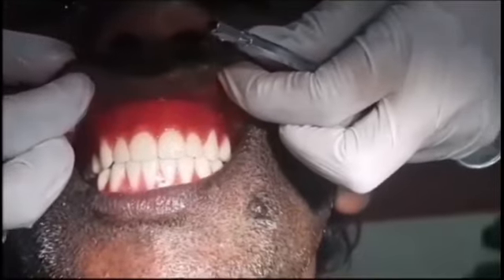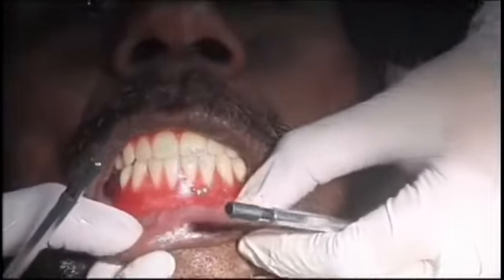Aesthetics: we see the midline, anterior plane, shape, size and shade of the teeth, and lip form in profile. Phonetics: the patient will be asked to speak. Sounds such as P, P, P, B, B, S, F are tested.